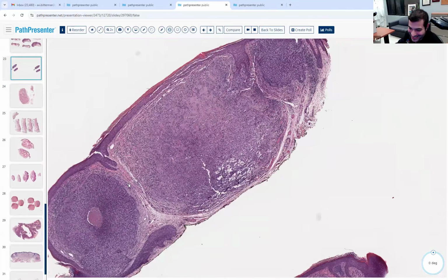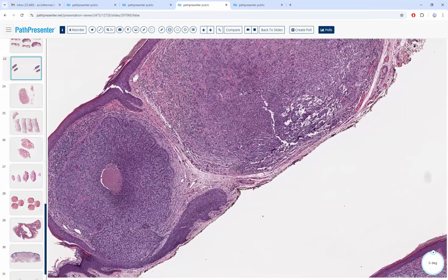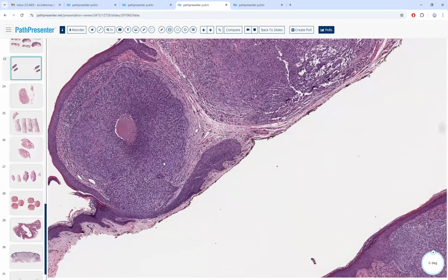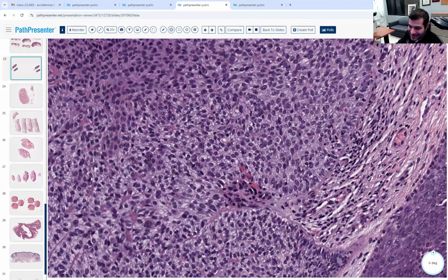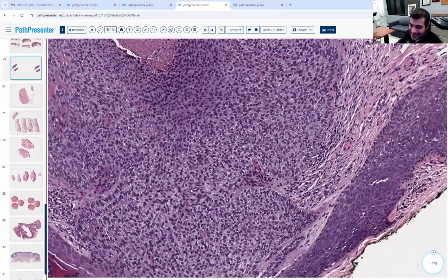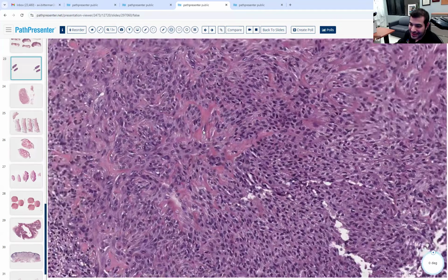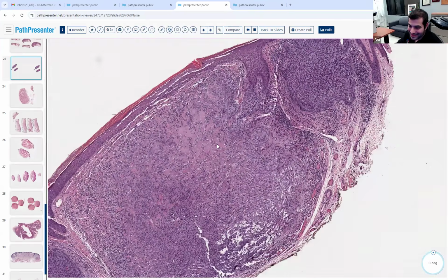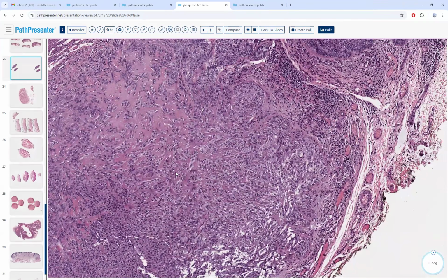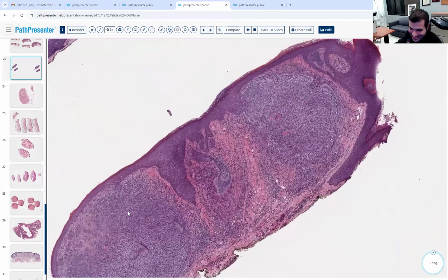What about this one? I see a huge blue cell tumor in the dermis, with some eosinophilic change in the center. I think these are just blood. But there are actually some eosinophilic areas that are not blood, actually, you're right. And here too. Look at this. So what's this? Is that a desmoplastic stroma? Desmoplastic stroma. Yes.